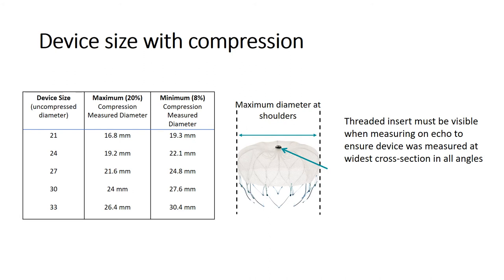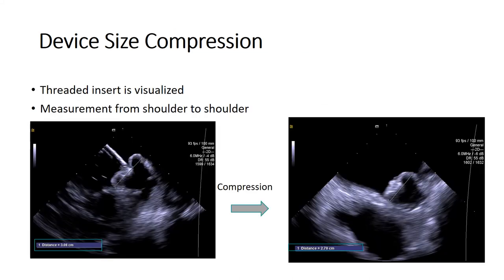The device is measured with 8% to 20% compression. The chart on the left displays the range of compression measurements for each device size. When performing the measurement, the threaded insert must be visible and a maximum measurement is taken at the shoulders of the device. This is a good example of measuring compression rate from shoulder to shoulder with the threaded insert visualized on the image.